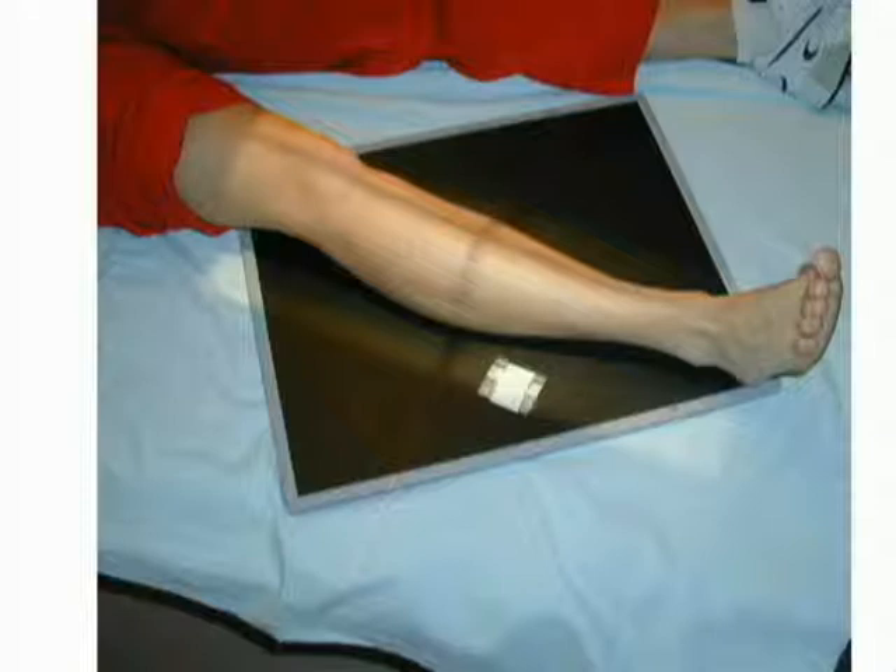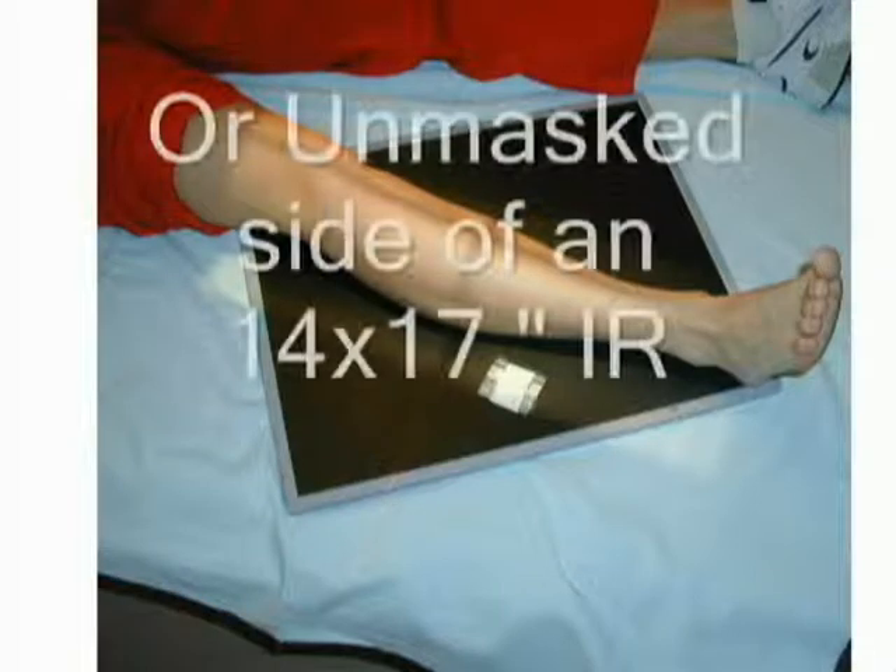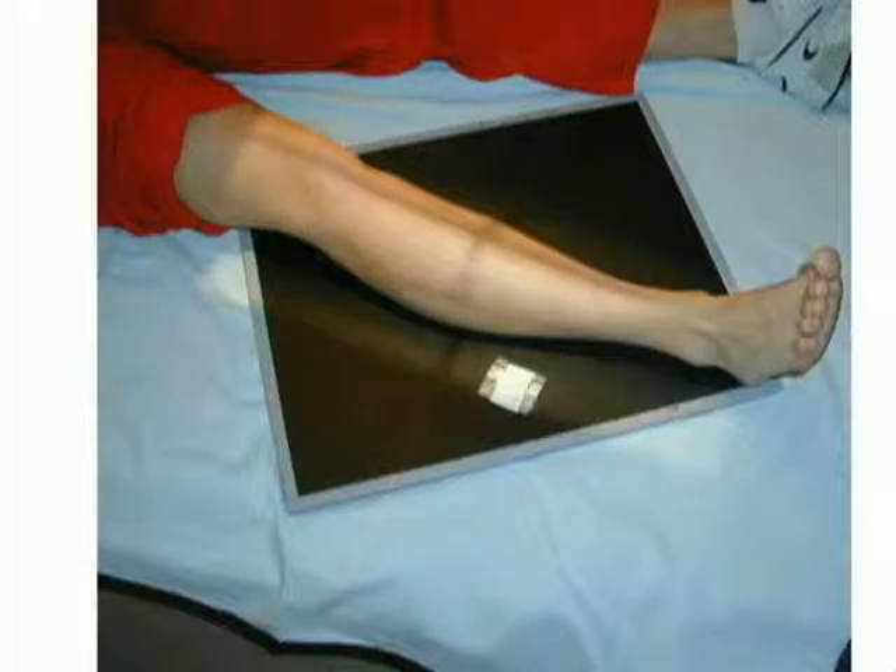The AP tibia fibula projection of the lower leg is performed with the patient seated on the table. A lead shield should be placed on the patient's lap for radiation protection. Extend the patient's leg, placing the femoral epicondyle parallel on the unmasked side of a 14x17 image receptor, or place diagonally on a 14x17 image receptor. Direct a central ray midpoint to the leg.